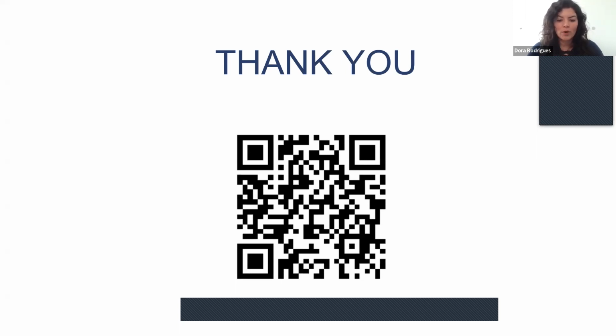Before, I wouldn't trust any printed material. I tried in the past, and I wouldn't trust any of it, because we had a successful conversion every single time. Our traditional dentures were fine, or even some digital dentures workflow I tried, and it worked fine. I did not want to ruin the conversions and the relationship that I had with my doctors because I wanted to switch to printed dentures.